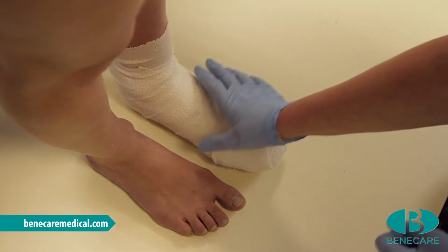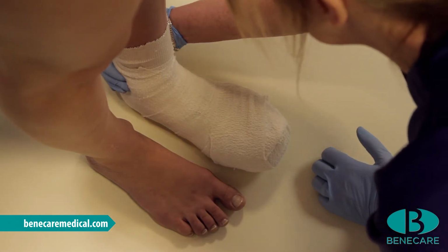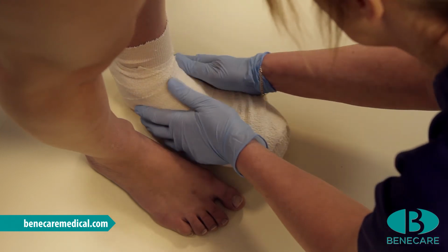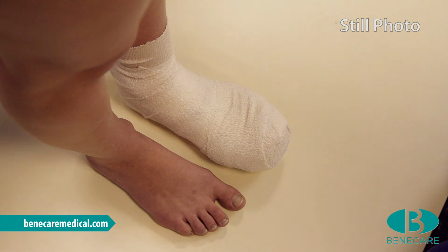To flatten the plantar aspect of the cast, stand the patient. Ensure the opposing foot is flat on the floor. During the moulding, I need to ensure the toes are in extension. I will mould under both malleoli and around the tendon Achilles, at the back of the heel. This will ensure the cast holds onto the foot securely during mobilization.